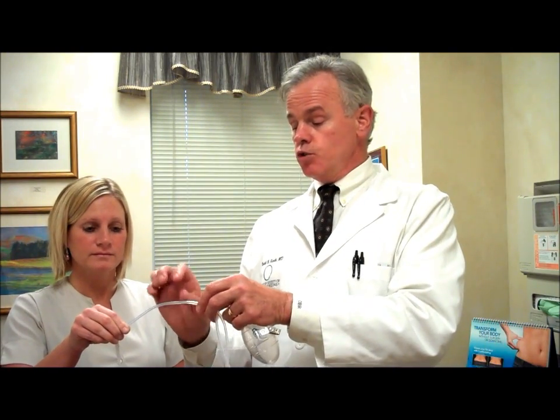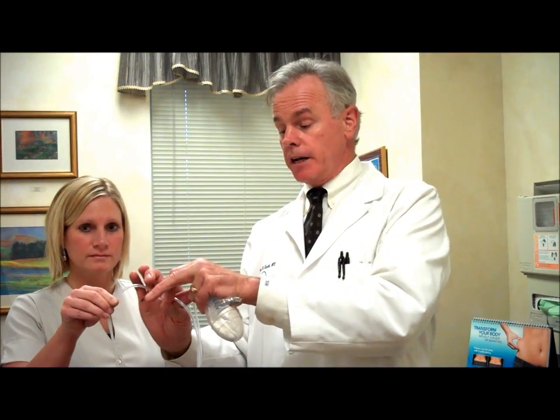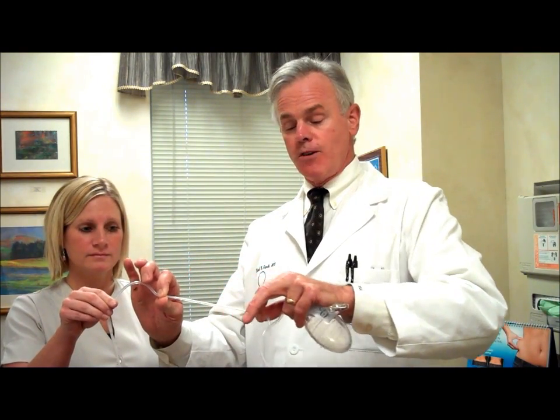The way you get it unplugged is to squeeze the drain close to where it goes into the body and draw it away from it like this. It creates suction, and then you let go of this hand and it helps milk whatever is in the tube into the drain. That's known as stripping the drains. You're probably going to want to do it every time you empty the drains. It'll just make them much easier to deal with.